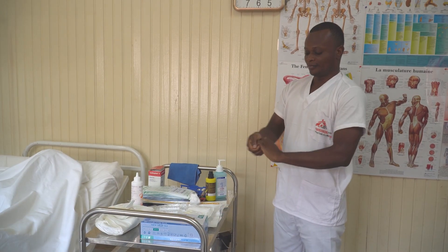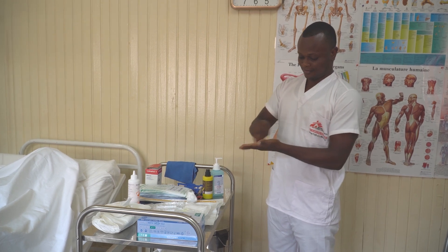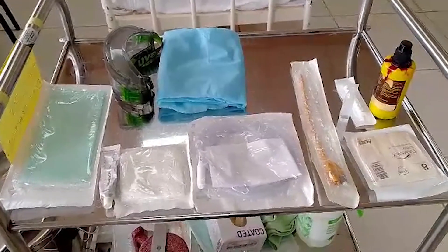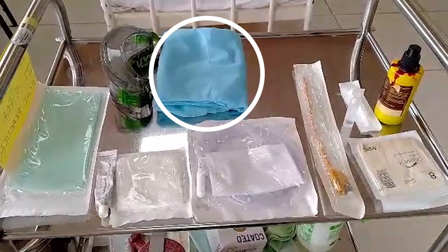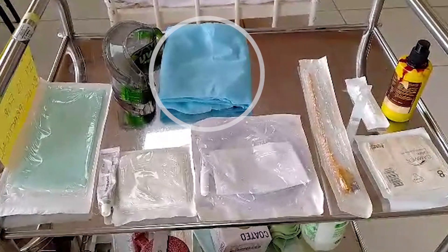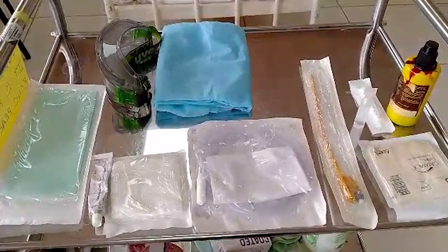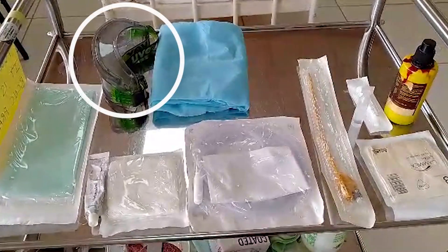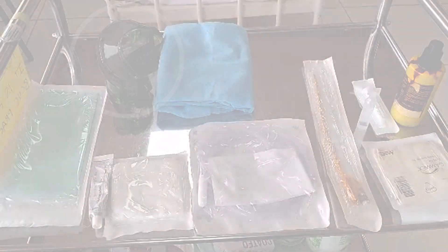Perform hand hygiene. Assess the risk of exposure and adapt PPE accordingly. Personal protective equipment could include the use of an apron to protect the healthcare provider from spraying or splashing of blood and other body fluids. If there is a risk of spraying or splashing to the mucosa, such as your eyes, nose, or mouth, the healthcare provider must wear protective equipment like protective glasses and a mask.